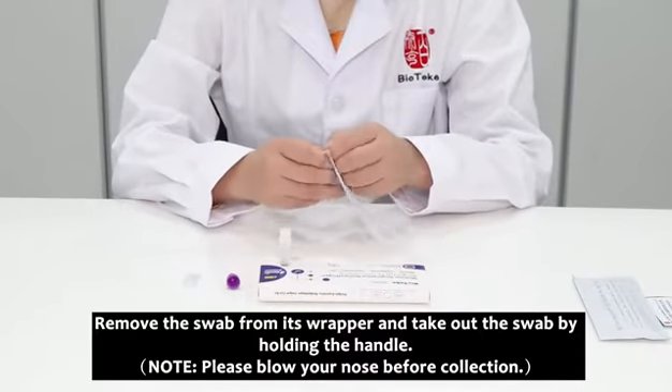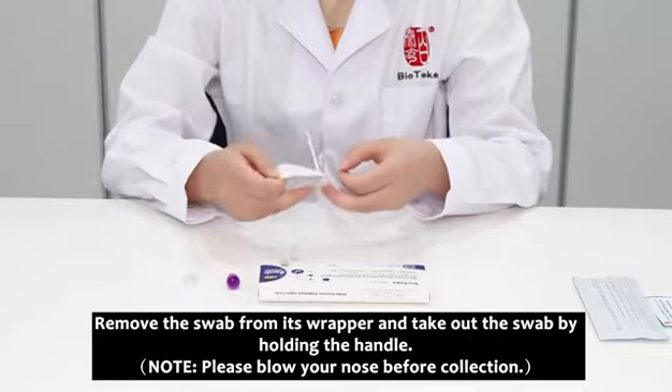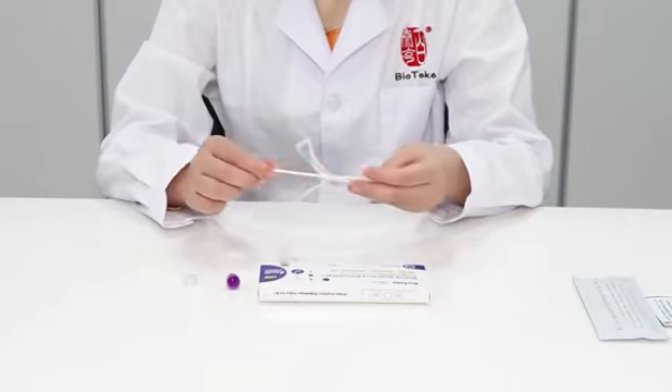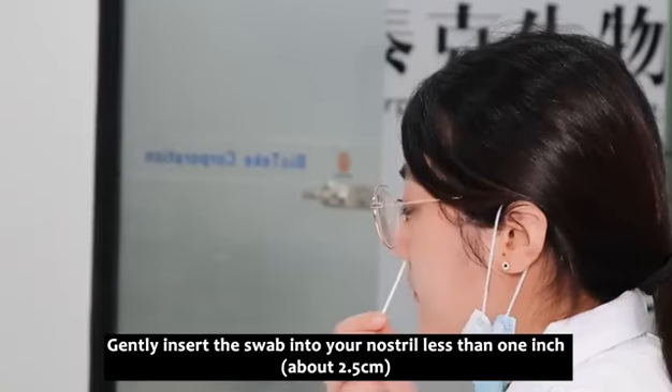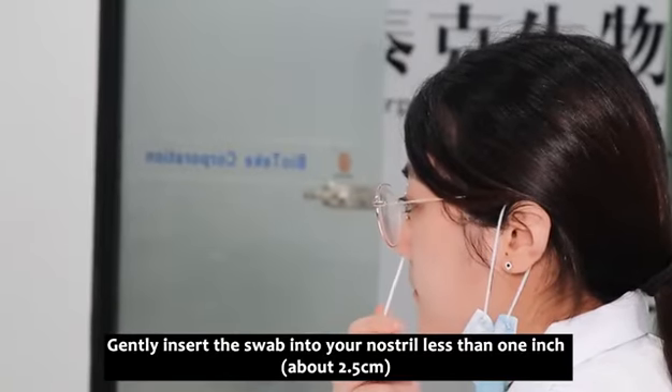Remove the swab from its wrapper and take out the swab by holding the handle. Gently insert the swab into your nostril, less than one inch, about 2.5 centimeters.